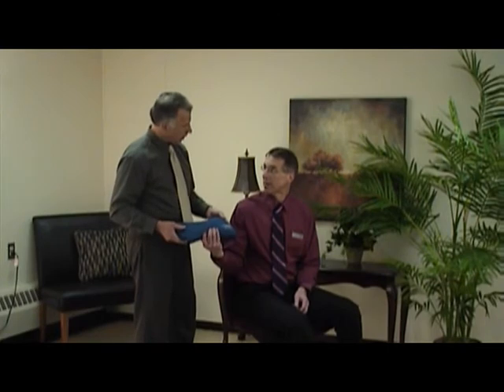Brad, can I just ask a question? Sure. Does this fill back up with air by itself then? Right, exactly. It certainly does. Let's see what happens with that. I'm going to squeeze the air out of it, like so.